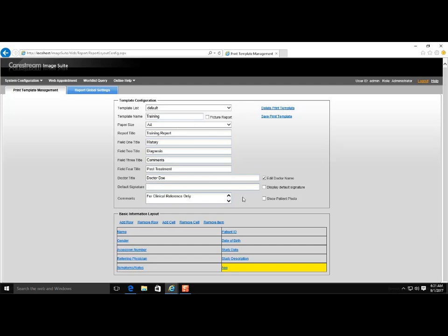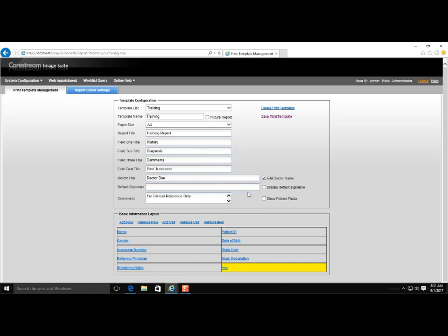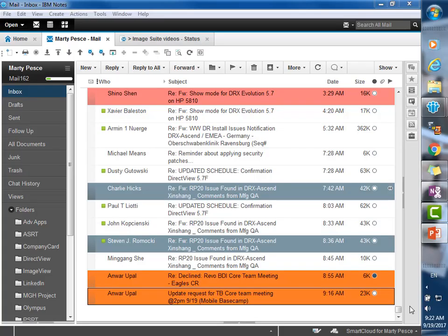When you are finished adding all information, click Save Print Template. An Operation Successful message will appear. Then select OK.